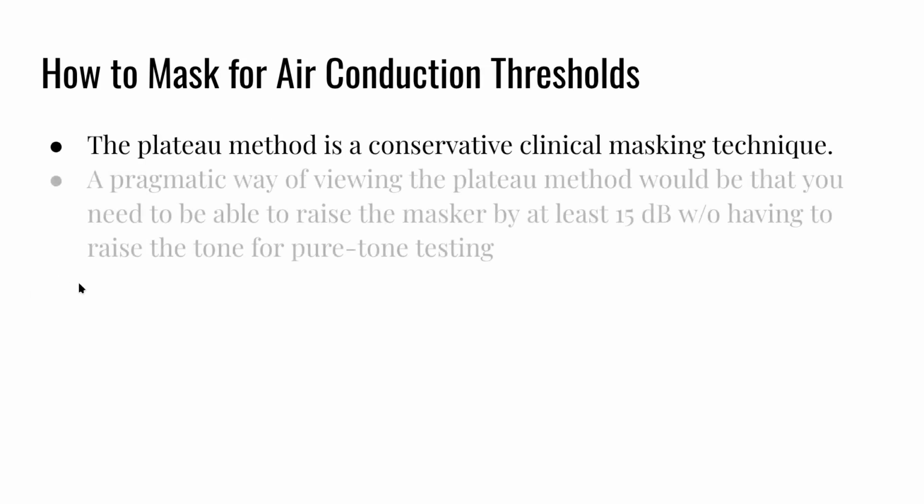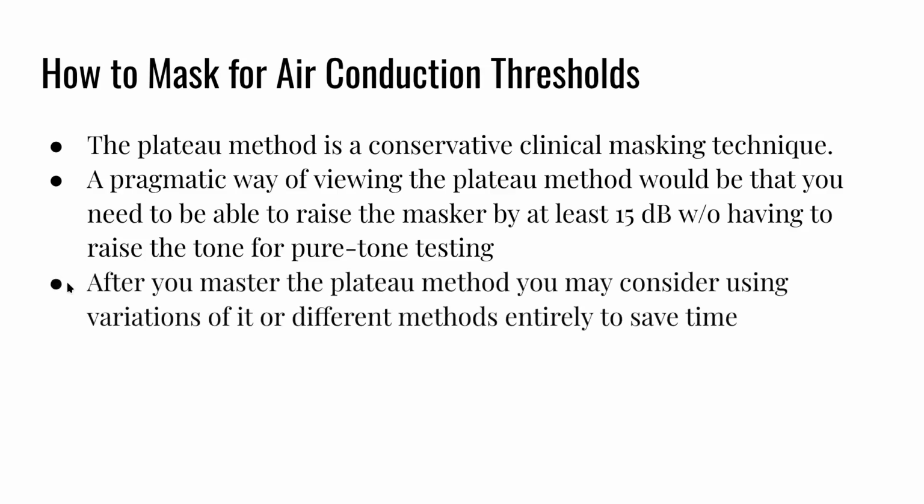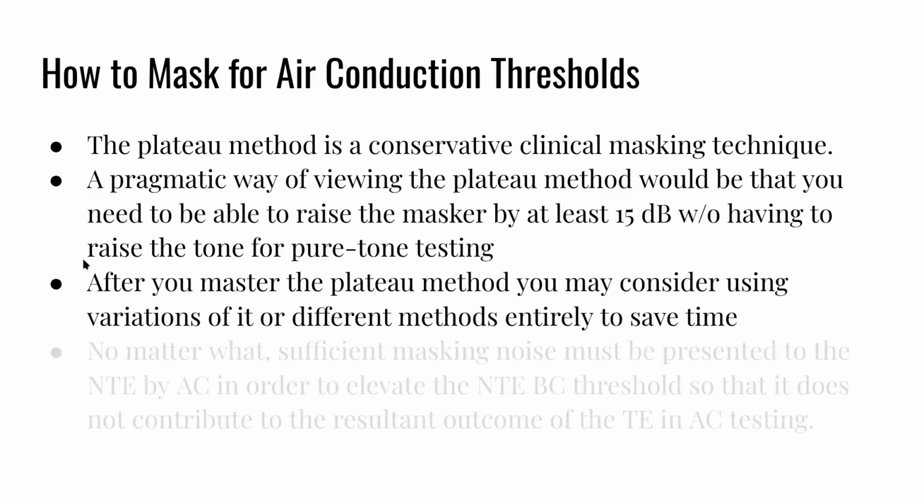Like I said, the plateau method is a conservative clinical masking technique. A pragmatic way of viewing the plateau method would be that you need to be able to raise the masker by at least 15 dB without having to raise the tone for pure tone testing. After you master the plateau method, you may consider using variations of it like the step method, or different methods like the Turner method entirely, to save time.